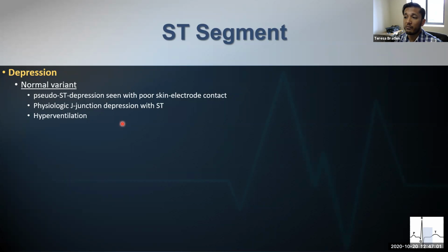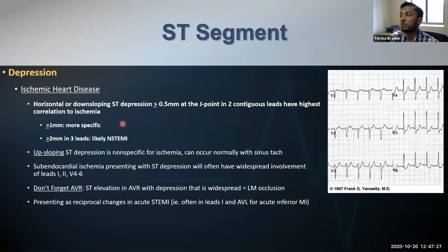So it can create the appearance of an ST segment depression because the electrical activity is not going through as well. Maybe there's a J point change, which can be physiologic, which we talked about, that can cause ST depression as well, or even just hyperventilation, which I didn't know about. Your classic would be an asthmatic coming in with hyperventilation. And then when we see their respiratory rate start to normalize and their CO2 go up, that's when your sphincter should tighten because that person is tiring out and they're about to decompensate on you. So hyperventilation is something to know of as a normal variant.